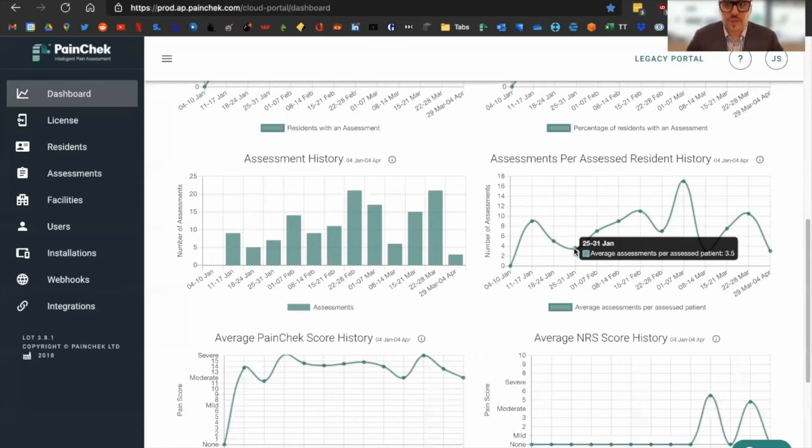That's pretty straightforward. At the same time, it may mean that our team's priorities have shifted, or we've fallen a little bit behind the curve in terms of doing as much assessment as we should be doing to make sure that we're hitting our best practice standards. So something for us as a manager to follow up and determine why, but we can see there that that change has happened.